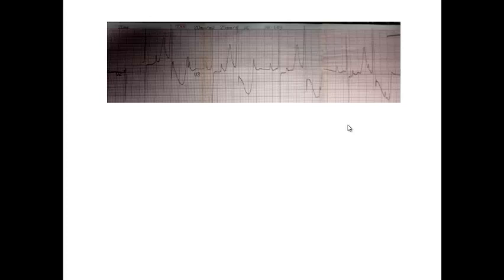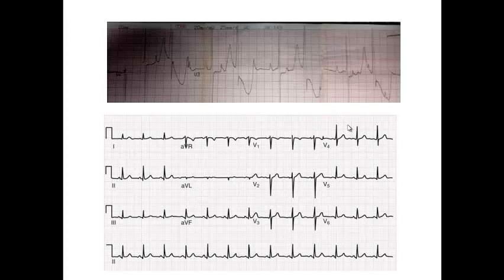And so we have 2 patterns. This pattern is the long paper strip that we usually don't prefer, but sometimes you may be faced with a situation in the ER where you see an ECG for a patient in this form. But the most preferred form is this long rectangular paper, which shows you 3 groups of vertical ECG leads.